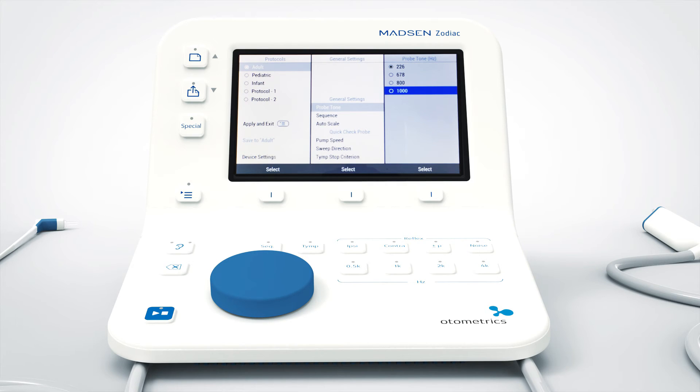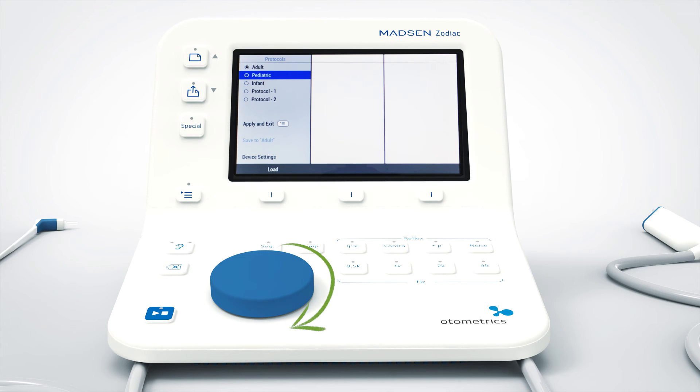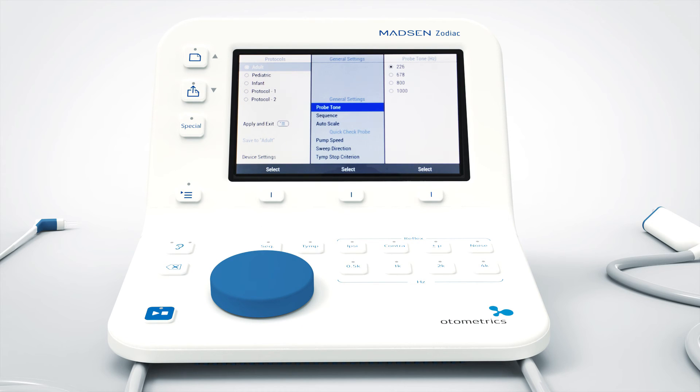I want to increase the pump speed for my adult protocol. In the first column of the menu I select adult by navigating with the wheel and clicking this button. This takes me to the second column, where I select pump speed in the menu by turning the wheel and pressing this button. Now I am in column three where I choose my new pump speed by navigating the wheel.